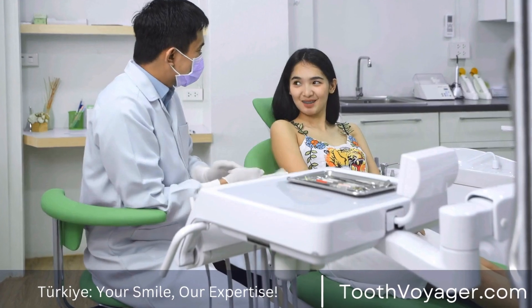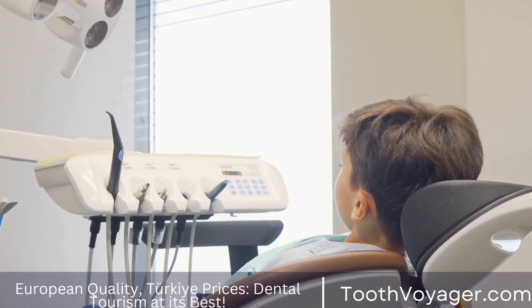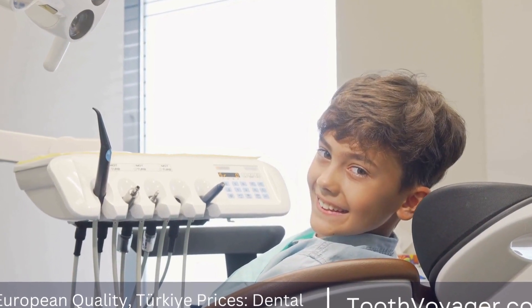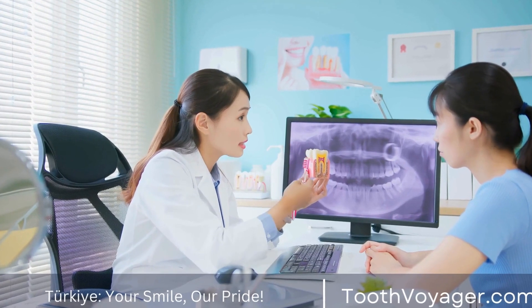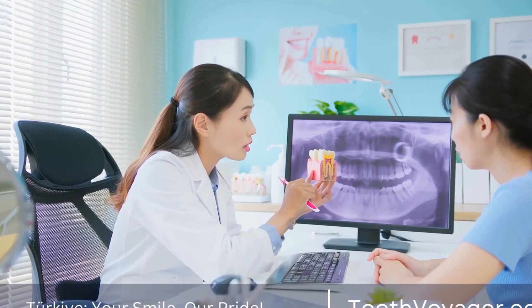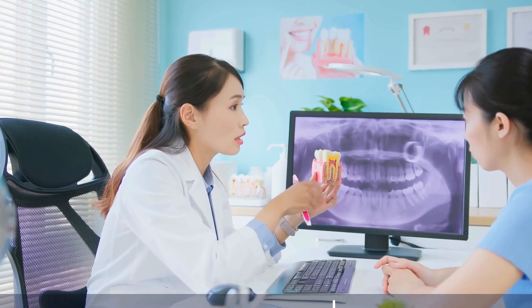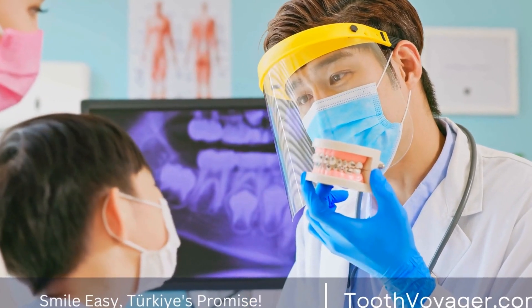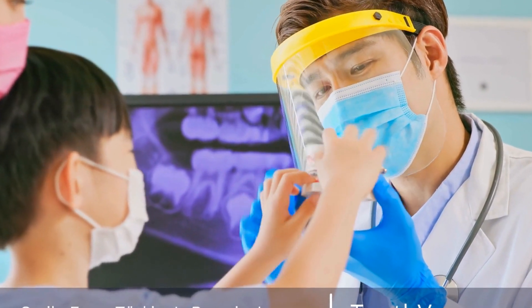The role of dental x-rays in diagnosis. Dental x-rays play a crucial role in diagnosing various oral health conditions, including cavities. X-rays can detect cavities between teeth or below the gum line, where they may not be visible during a visual examination. X-rays can also reveal signs of gum disease, such as bone loss and changes in the supporting structures.